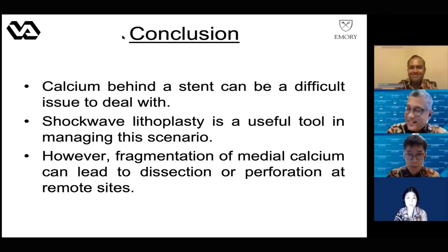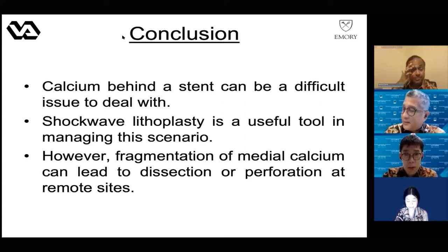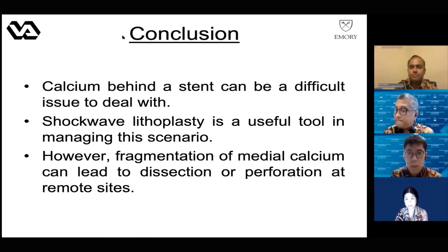Sure. We reported and compared this type of case. Using OCT, we picked up about 30 cases with stent underexpansion due to calcium behind the stent. Some of them, the operator decided to do excimer laser with contrast, and some were not. Clearly, the patients who had the laser had good fracture behind the stent, and they made good stent expansion. But I do think this is a last resort if you really need it. But we know that it works sometimes. Thank you very much.